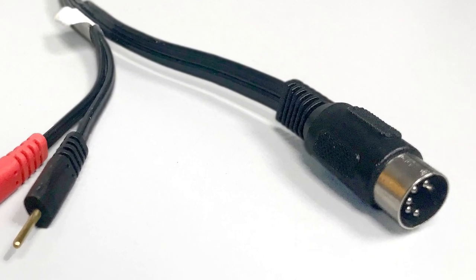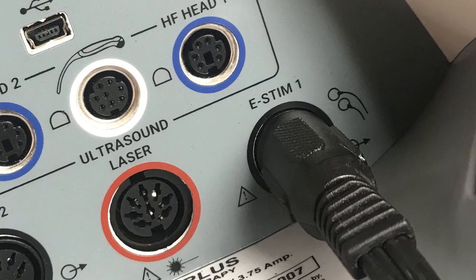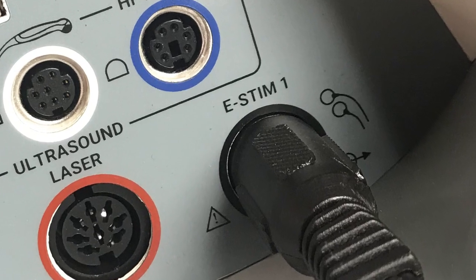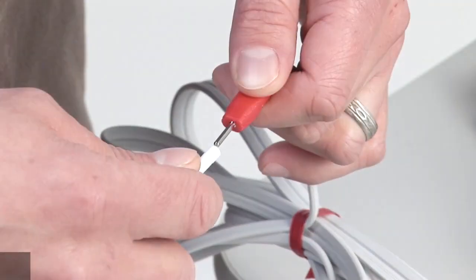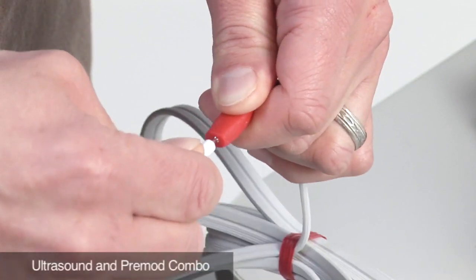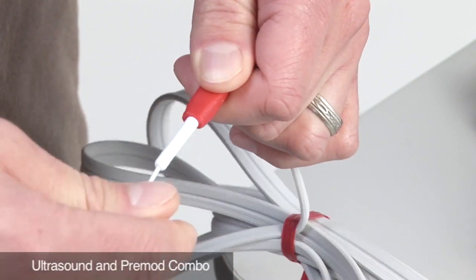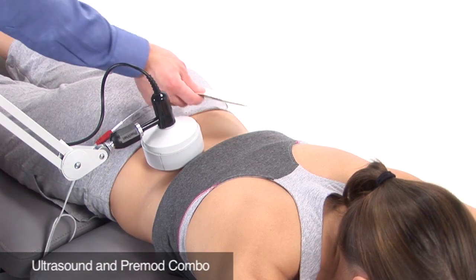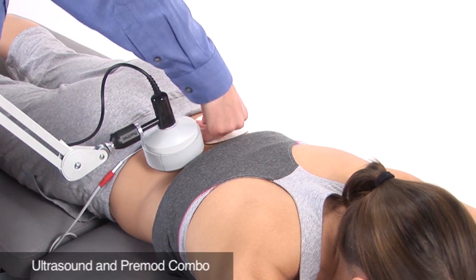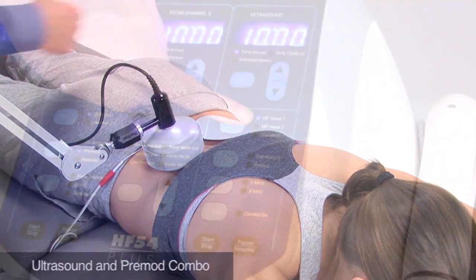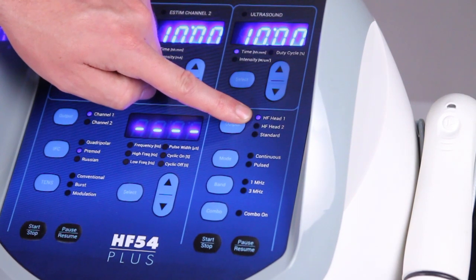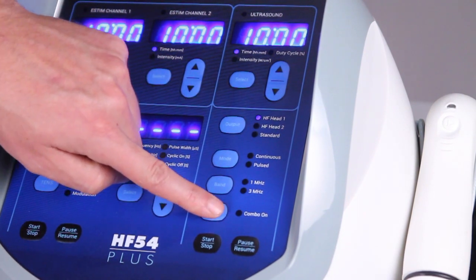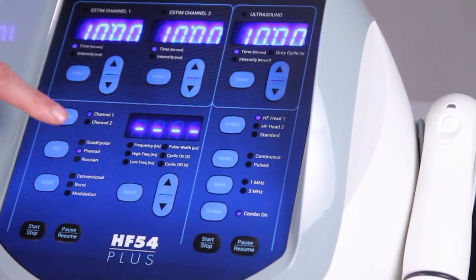To use combination therapy with ultrasound and interferential muscle stim, first plug the muscle stimulation wire into the back of the HF54 Plus generator under e-stim one. Plug the large two and three quarters by four and three quarters dispersement pad into the red lead wire from channel one. Position the electrode adjacent to the sound head. With the HF head one sound head selected, press combo to enter combination mode.